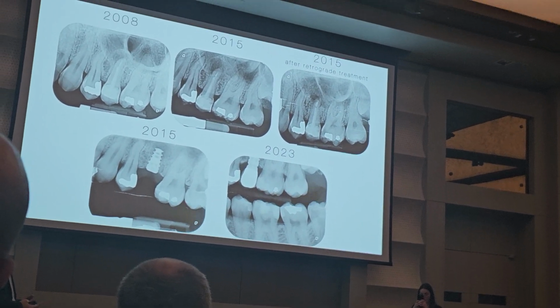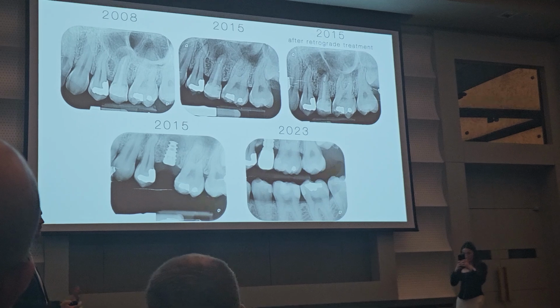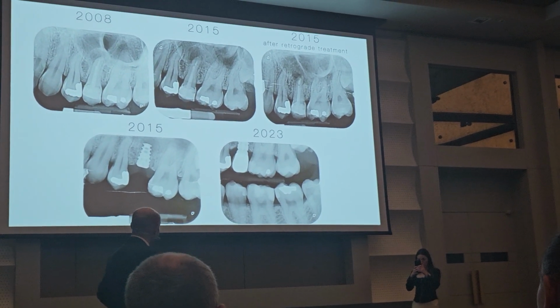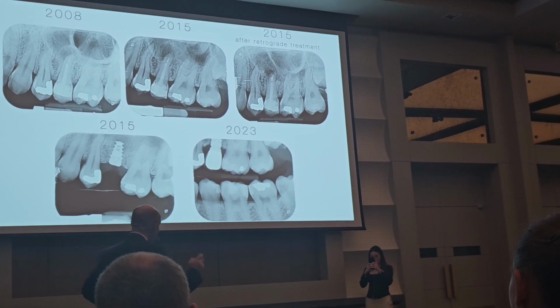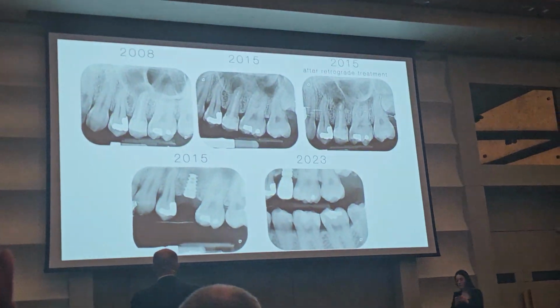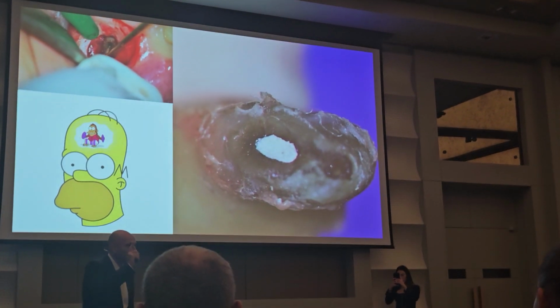I did a lot. By the way, in that week, I received my first camera for the microscope. So I was very happy to publish something on Facebook. And this is what I did. On the same day, I published on Facebook the video of the apical surgery. I was so concentrated on the video. Look, I filled just one canal.